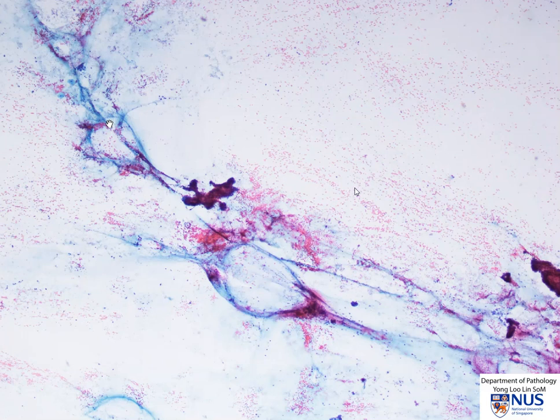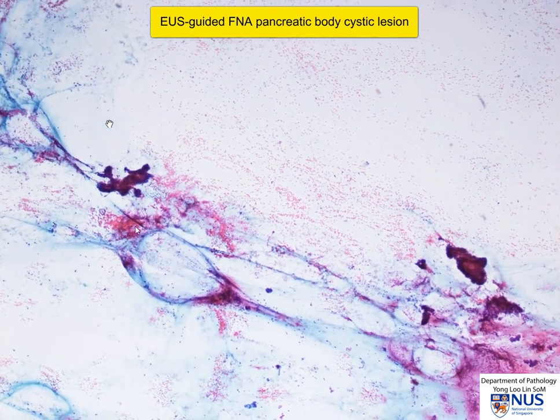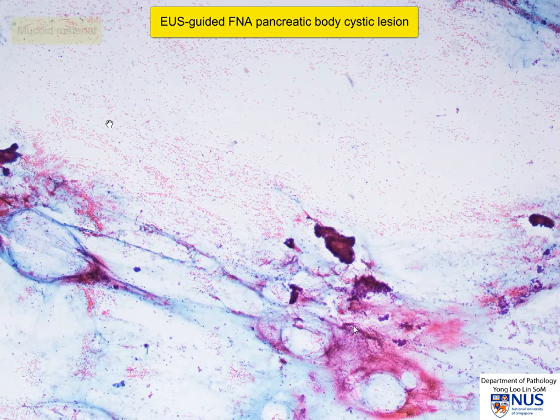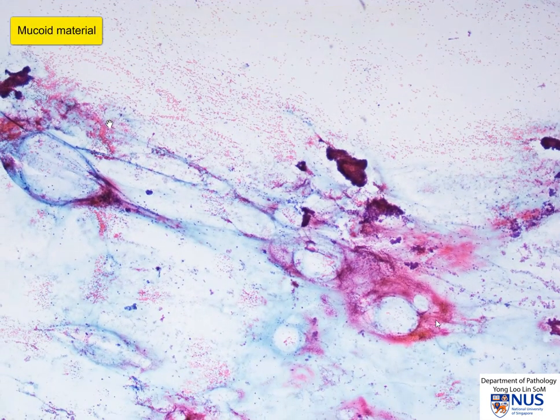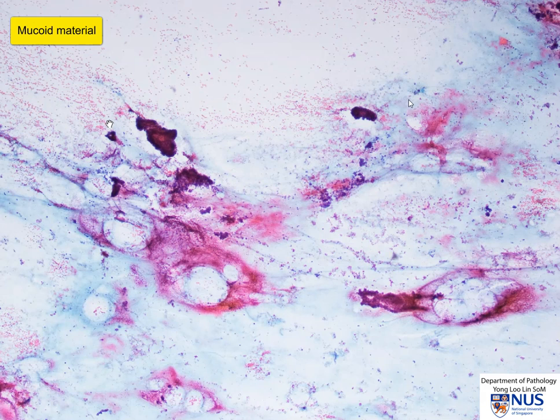Here is an alcohol-fixed smear from an EUS FNA sample taken from a cystic lesion in the body of the pancreas. As we move around at low power, we can see that there is some mucoid material in the background, as well as some tight, cohesive clusters of cells.